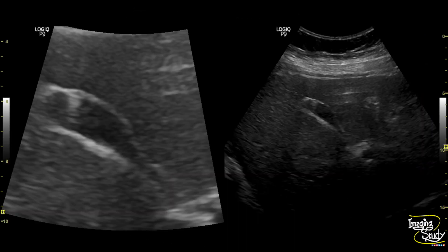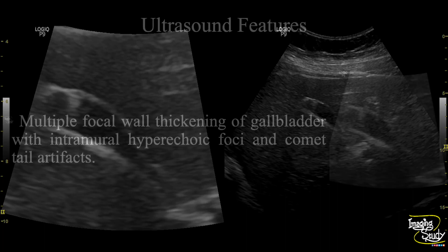Here is another picture. You can see the gallbladder with comet tail artifacts. In this picture the focal wall thickening is not well visualized, but on the magnified image on the left, you can see the focal wall thickening quite better.